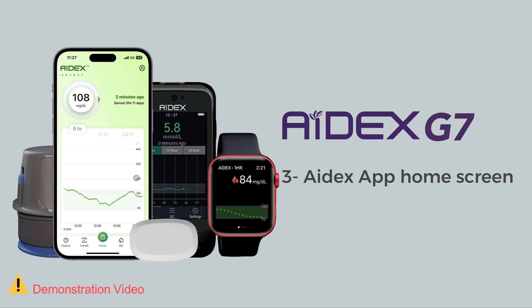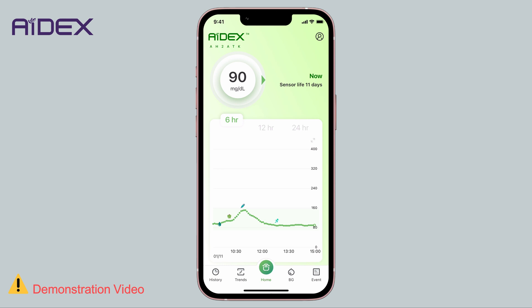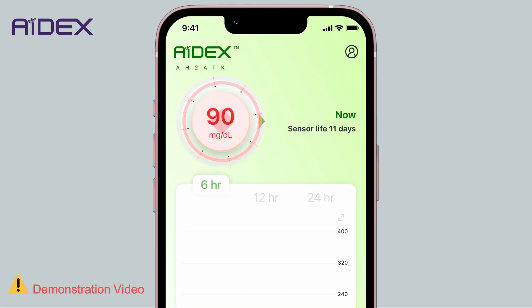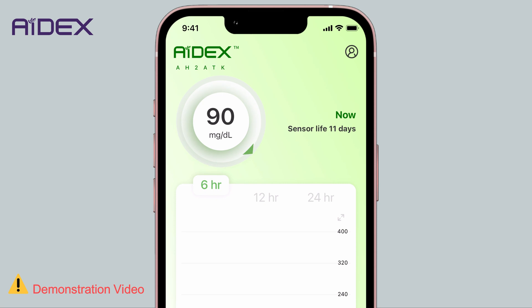On the Adix home screen, the current blood glucose level is displayed, along with the time when this reading was recorded. The arrows signify the anticipated direction of changes in the blood glucose trend.